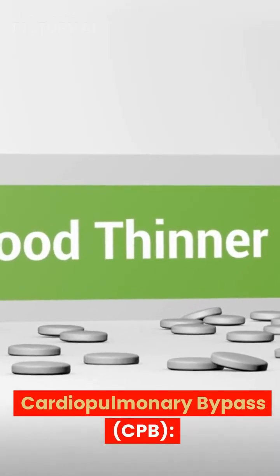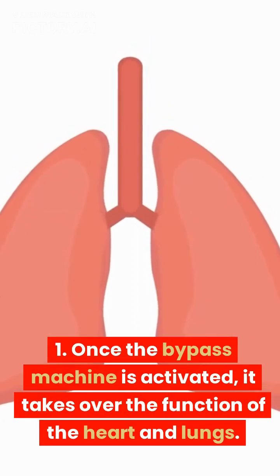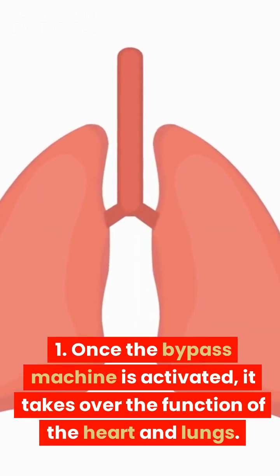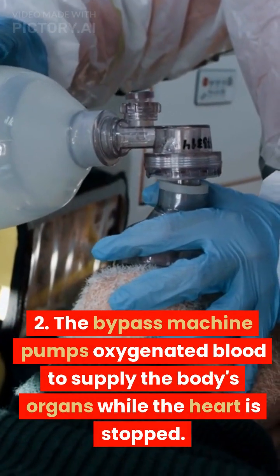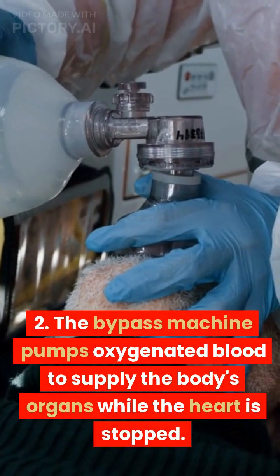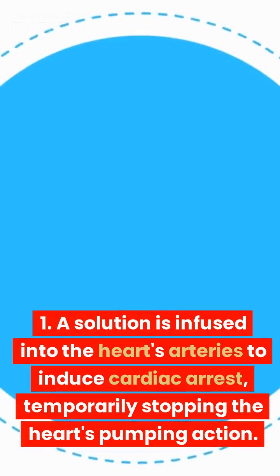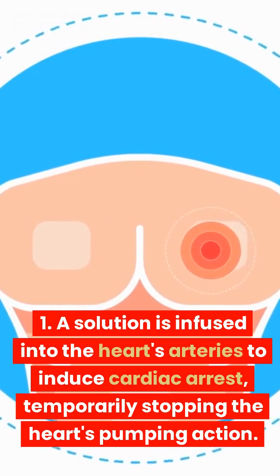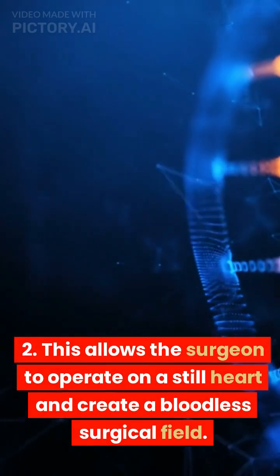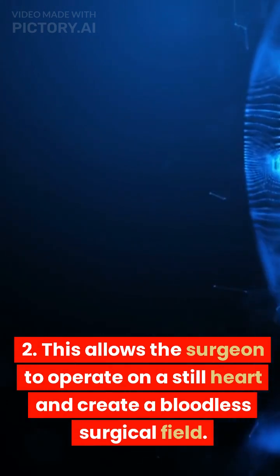Cardiopulmonary bypass, CPB. 1. Once the bypass machine is activated, it takes over the function of the heart and lungs. 2. The bypass machine pumps oxygenated blood to supply the body's organs while the heart is stopped. Cardiac arrest. 1. A solution is infused into the heart's arteries to induce cardiac arrest, temporarily stopping the heart's pumping action. 2. This allows the surgeon to operate on a still heart and create a bloodless surgical field.